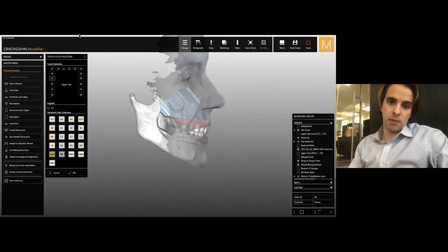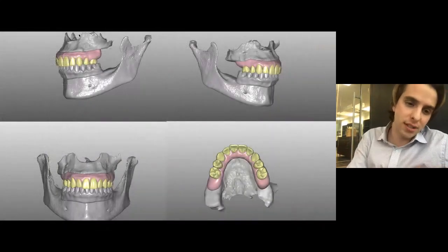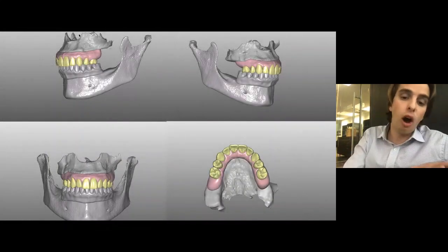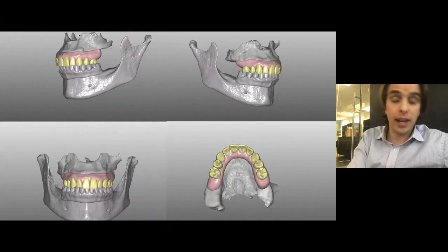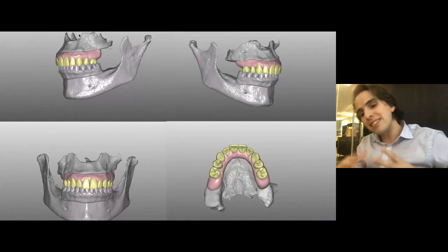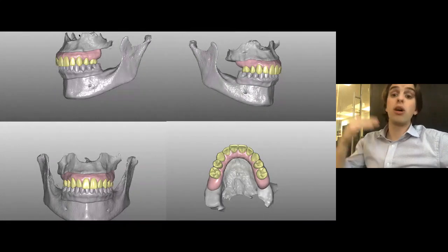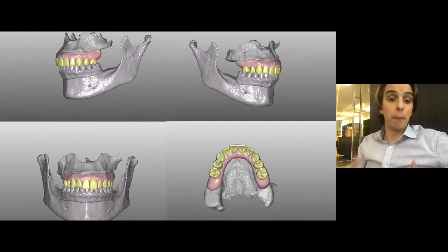And really, we can use virtual tools to improve the interdisciplinary collaboration between the restorative team and the surgical team. I believe at a minimum, it's fundamental to assess the virtual tooth setup on the DICOM. And yes, maybe the clinician doesn't want to work with the surgical guide, but at least having this conversation really will take us one step ahead of the pickup technique.